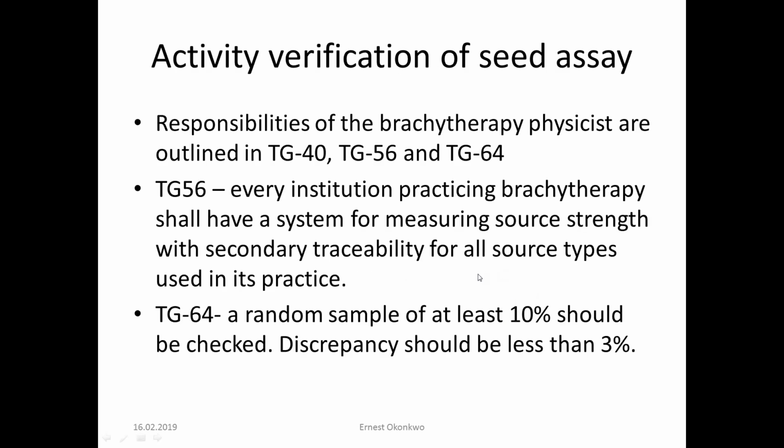It's also important to verify the seed activity. With us, with the sources from Bebig, the sources have to be sterilized. So we are not able, of course we are able, but we don't want to play around with the source before the implant. So what we do is that we do the implant and then we verify the remaining seeds. So that's how we do it.